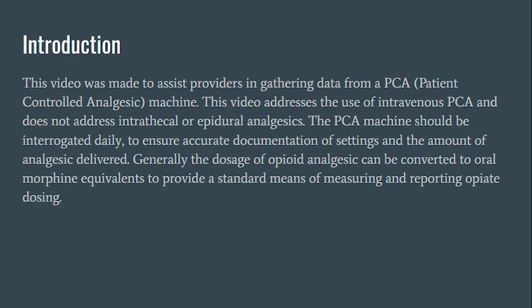The PCA machine should be interrogated daily to ensure accurate documentation of settings and the amount of analgesic delivered. Generally, the dosage of opioid analgesic can be converted to oral morphine equivalents to provide a standard means of measuring and reporting opiate dosing.